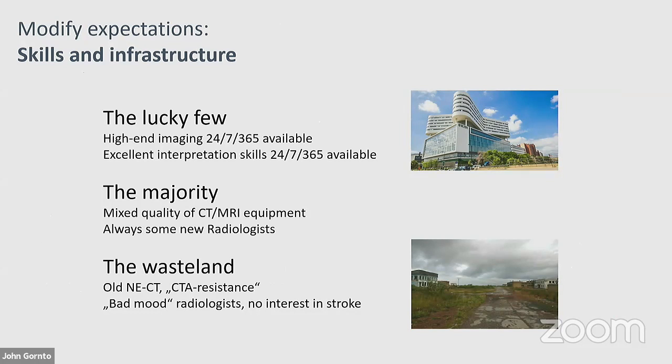And I think this is exactly the place where, if we have an automated image analysis system like the Olea or Rapid, that's exactly one of the places where it should be done, because it generates a bar where you can jump over and say, okay, the system says go, and then we go.